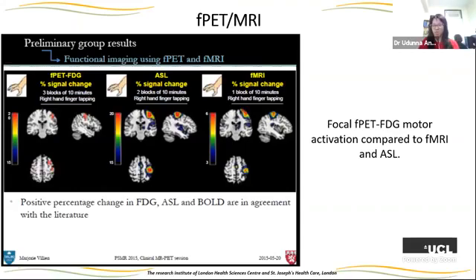experiment multiple times. And by repeating it multiple times, we're able to minimize inter-person or inter-subject variance. And also it actually allows us to boost our signal, for lack of a better word. So you have to do that control label experiment multiple times, at least a minimum of what's equivalent to 5 minutes on a 1.5T MRI scanner.